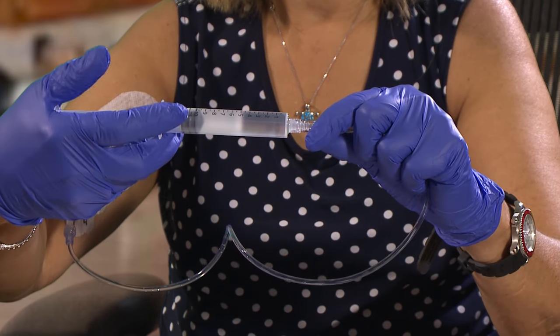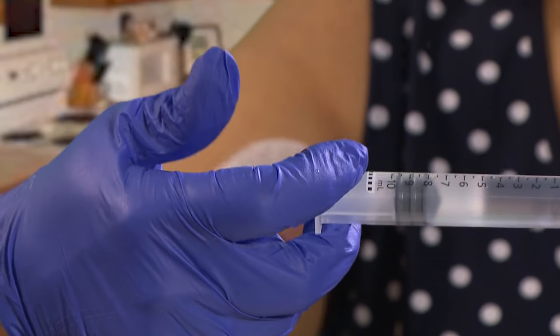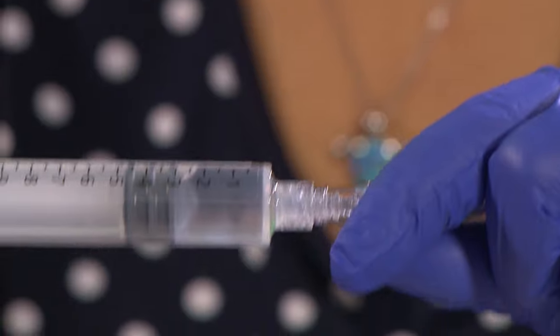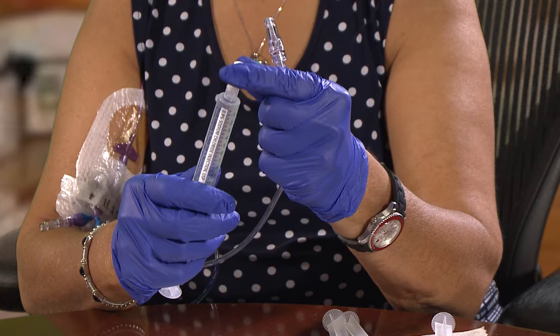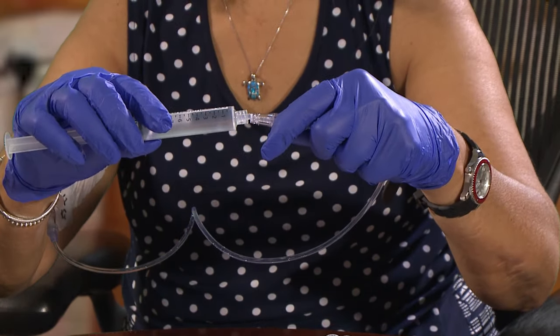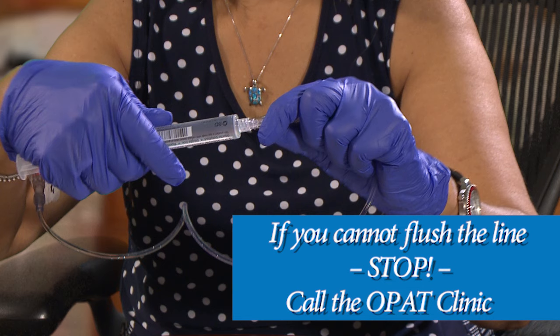Next, push the saline through the PICC line extension in a pulsating manner, starting and stopping over and over. This will make sure the line is open and the saline flows easily. You will need to use two saline flushes before giving your antibiotic. If the saline does not flow smoothly or you cannot push the saline through the line, stop and call the OPAT clinic.